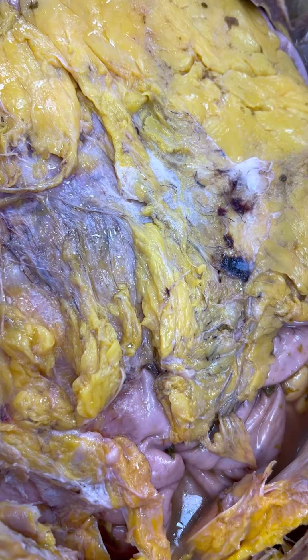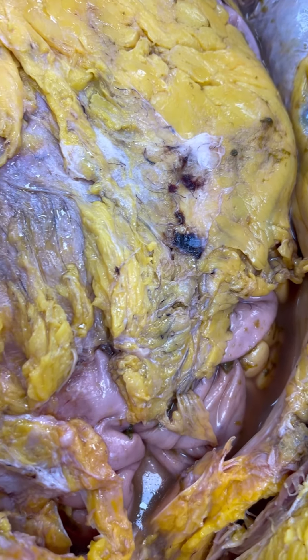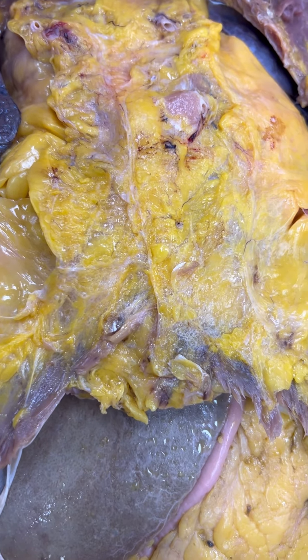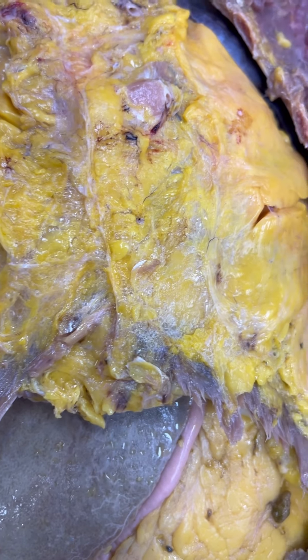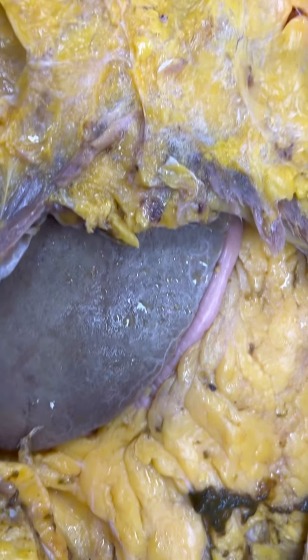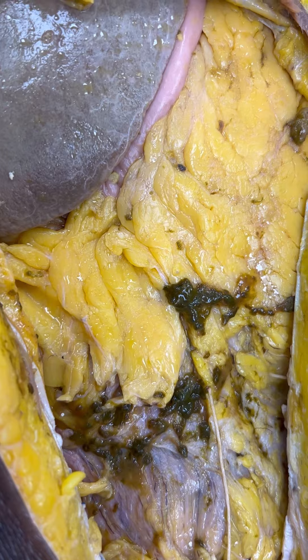We'll say more once we examine the organs further. We are viewing the chest cavity after the breastplate has been removed; the organs are in their usual orientation. The heart silhouette seems like it's a bit expanded, so we will see what that is about. You can see the liver and the stomach; we have previously talked about the intestines here.